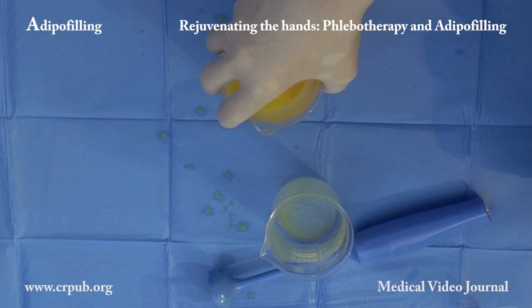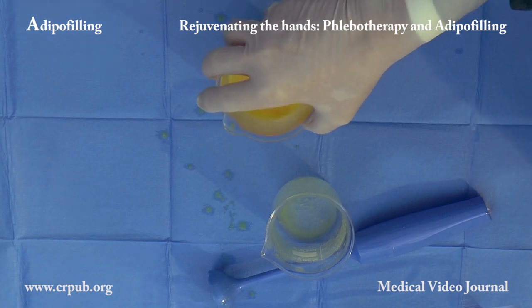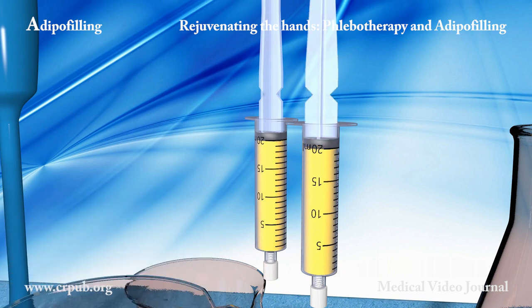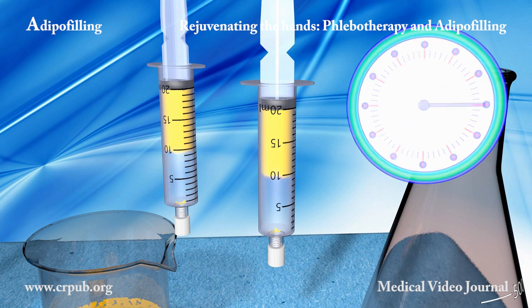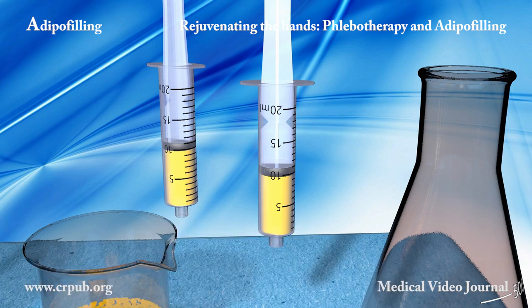The material is placed in 20ml syringes equipped with caps. The syringes are then placed vertically inside a beaker and left to stand, so that the lobular fragments and the single cells can separate from the fragmentation liquid by means of sedimentation.